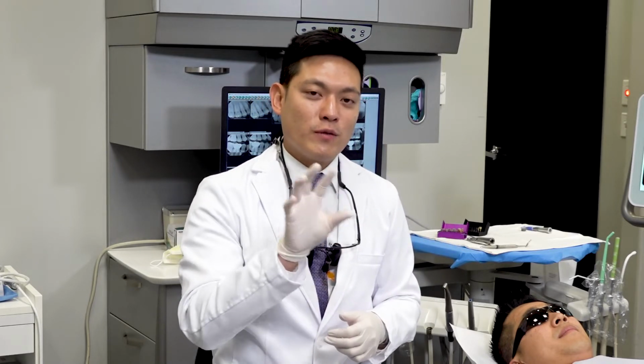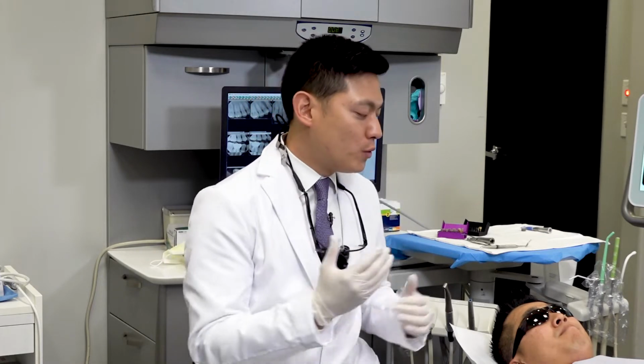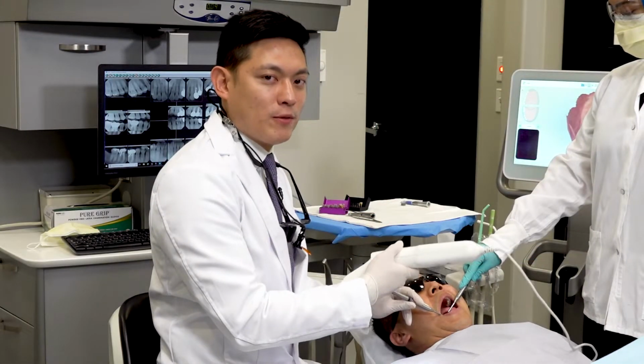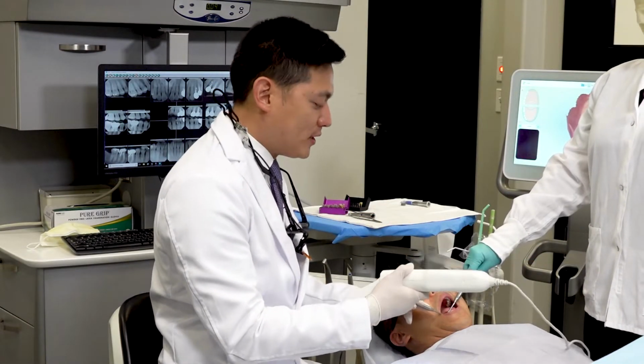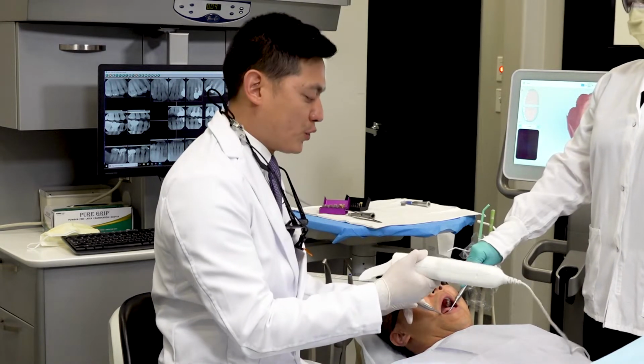If you see any sort of distortion, especially if it's close to the preparation, that can seriously negatively impact the accuracy of the restoration. So we'll go through some tips on how to avoid it, and hopefully that can help you with your digital scans. So we're currently working on a prep on the lower right quadrant, number 30, but I'll just show you what I typically try to do to avoid any distortions.